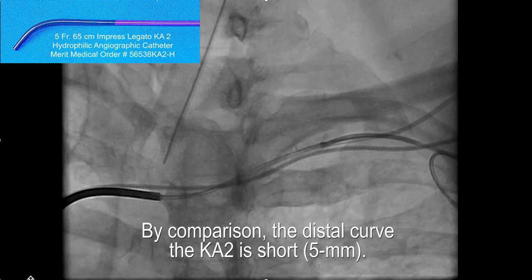By comparison, if you use this 5 French hydrophilic KA2 catheter — a braided hydrophilic catheter — it has a very short distal curve. I find that the shorter, the better for this particular purpose.